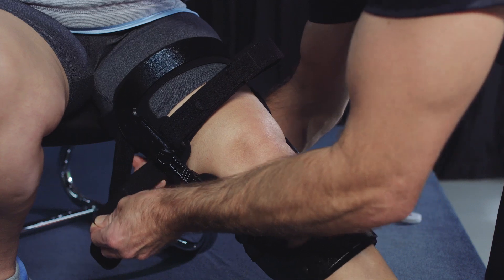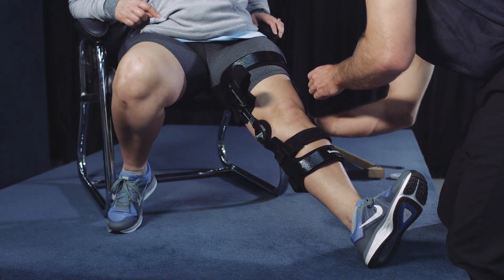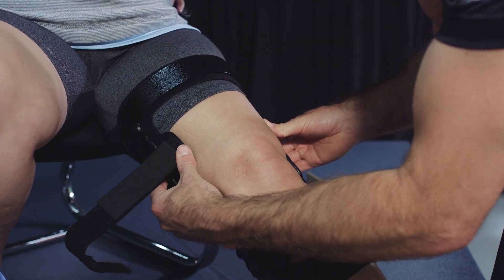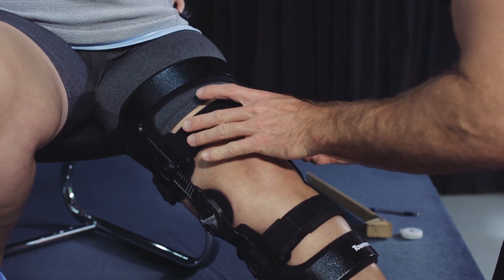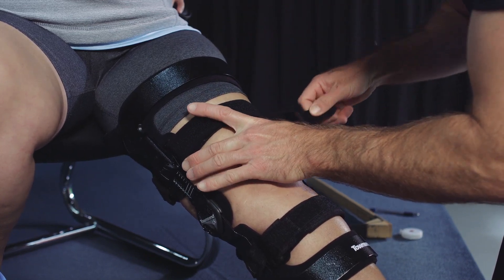Tighten the two posterior thigh straps to secure the upper shell. If the brace was ordered with the optional compression suspension package, or if the brace is a PCL model, there will also be an anterior thigh strap that needs to be tightened.